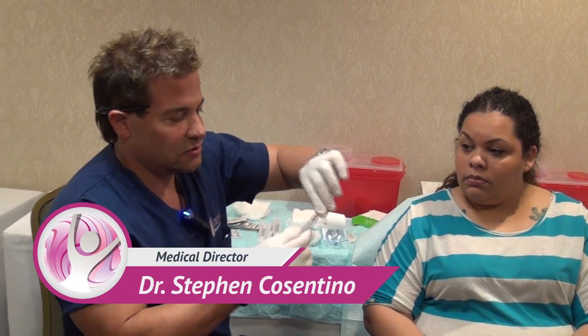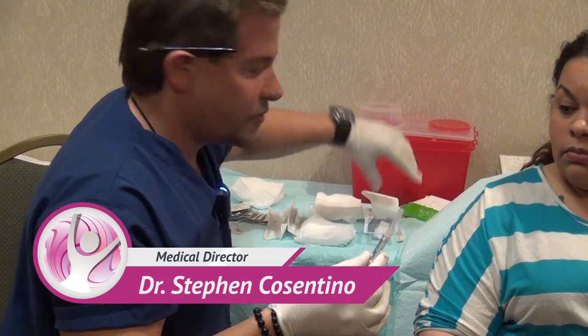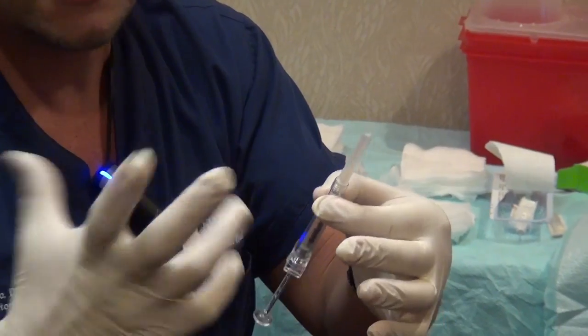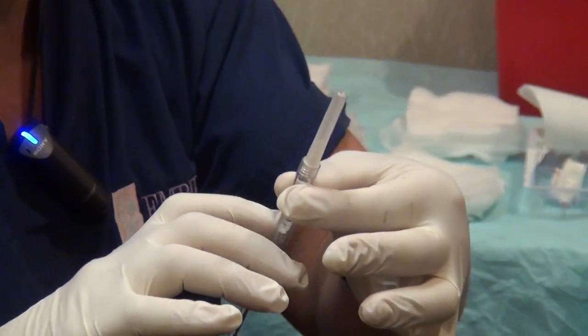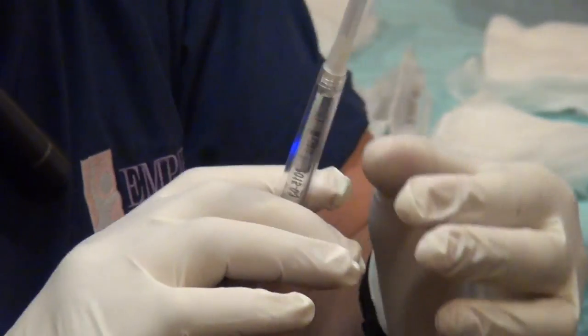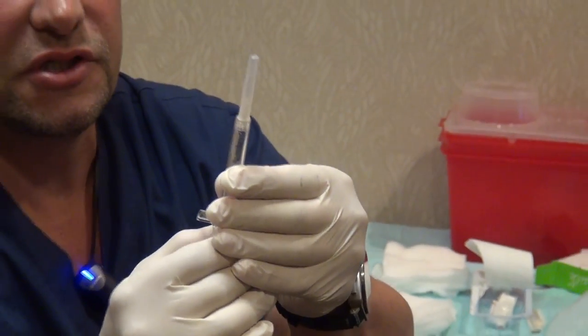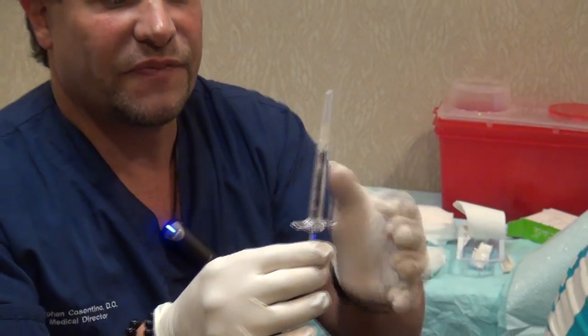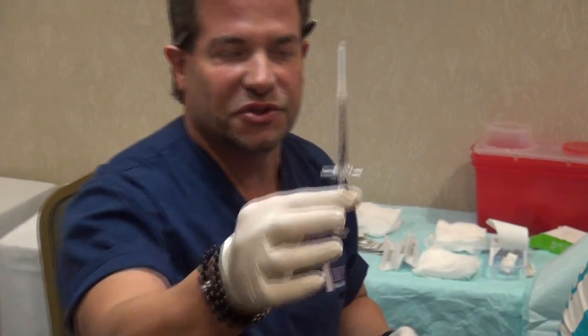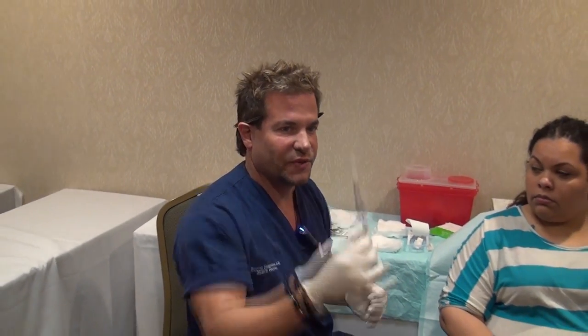It comes with a 30-gauge needle. Make sure when you screw on your cap that it's screwed on tight enough — if it's not, it can pop off. There's always a little air bubble in there; it's not dangerous, just push that through. That's basically what your syringe looks like — it almost looks like it's just air in there, but that's your product. It's a viscous hyaluronic acid.